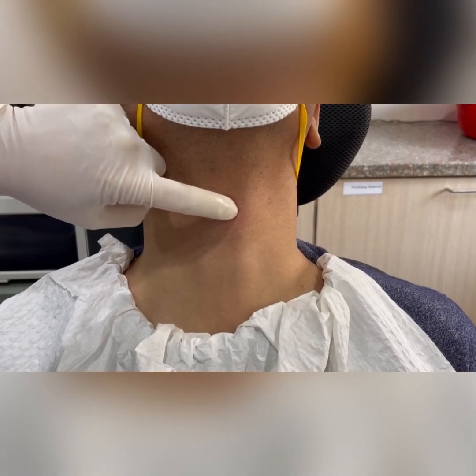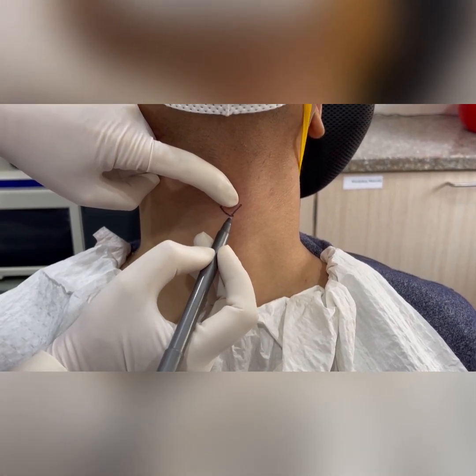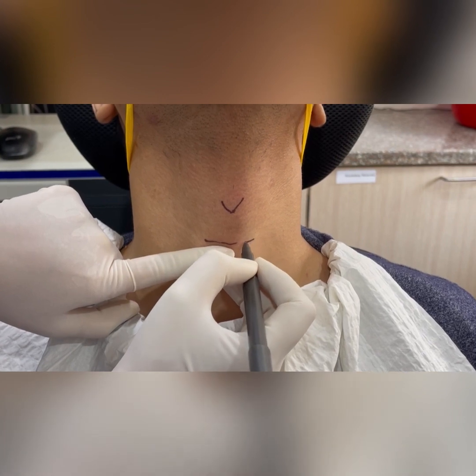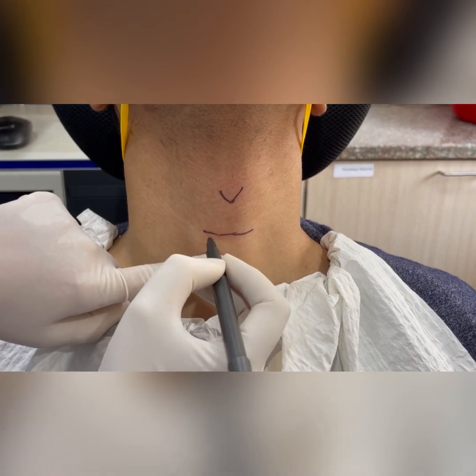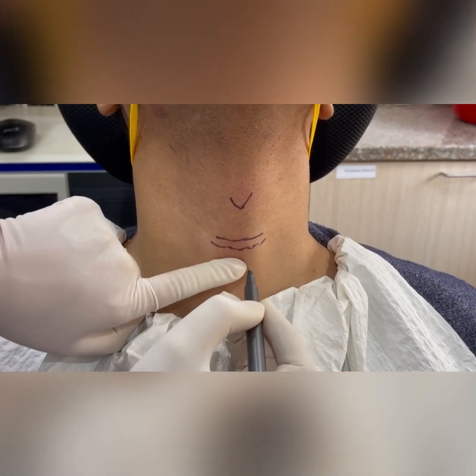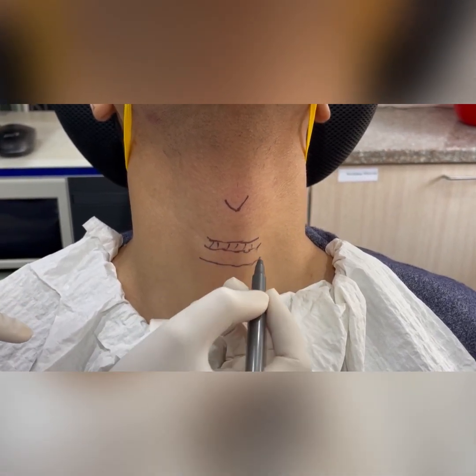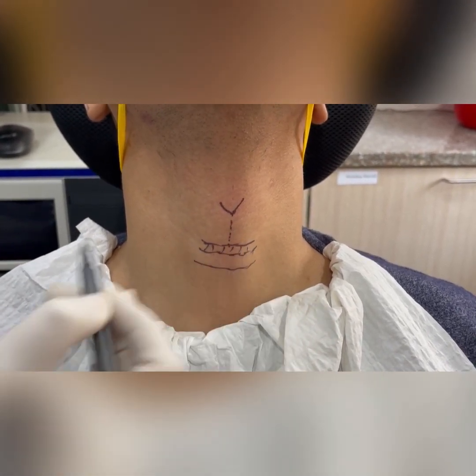The patient is sitting on a chair and we are going to make the surface markings. I palpate the thyroid notch, then palpate the lower border of the thyroid cartilage, and then palpate for the cricoid — this is the upper border of the cricoid cartilage. Here is the lower border of the cricoid cartilage, so this is the cricothyroid membrane, and this over here is our midline.